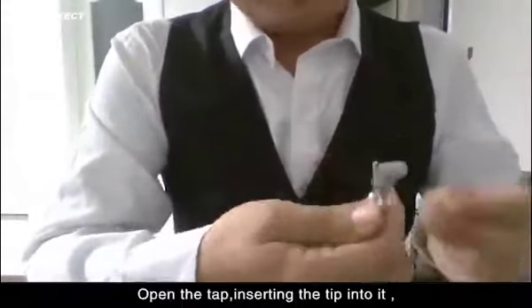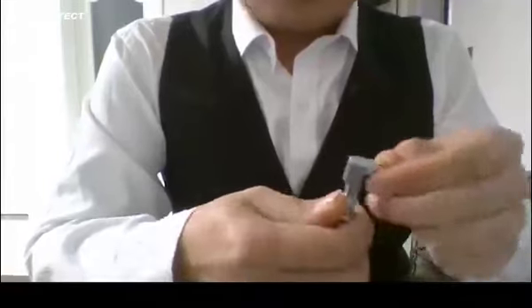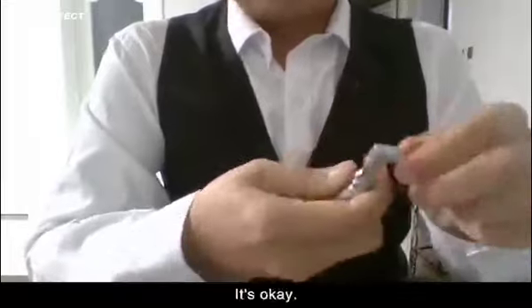Open the tab, insert the tip into it to the end, close the tab. It's okay.